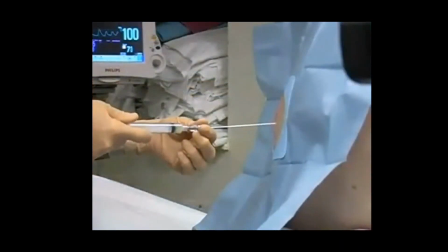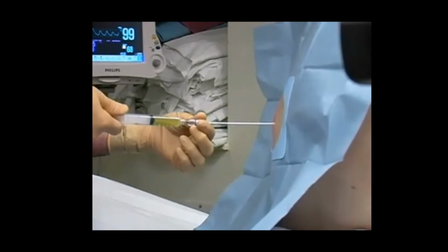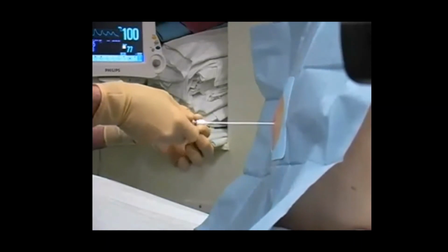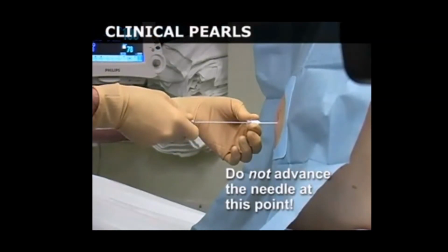Pull back on the plunger as you advance. Entry into the pleural cavity will be heralded by the aspiration of fluid into the syringe. Immediately stop advancement once fluid is obtained. Gently advance the catheter over the needle and into the pleural cavity. Be careful to not advance the needle at this point in order to avoid iatrogenic pulmonary injury.